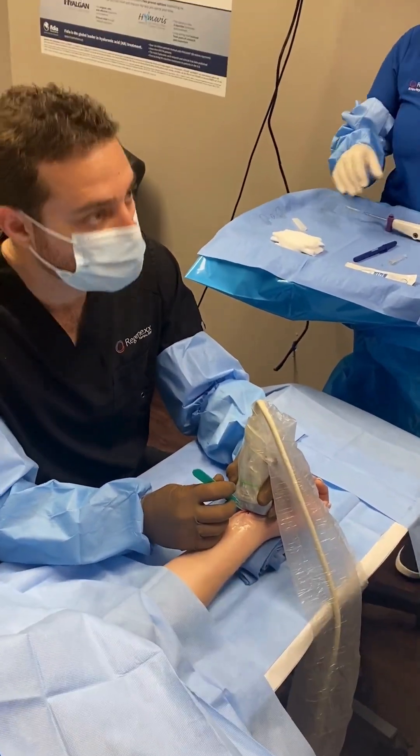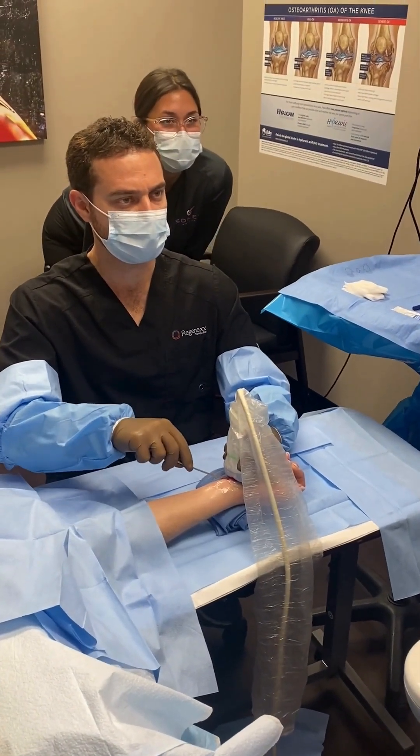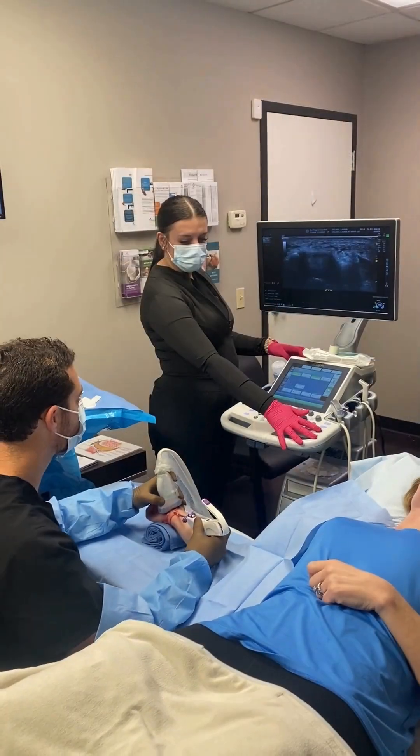We make a small incision and then put a probe into the wrist in order to prepare the area we're going to be working on.